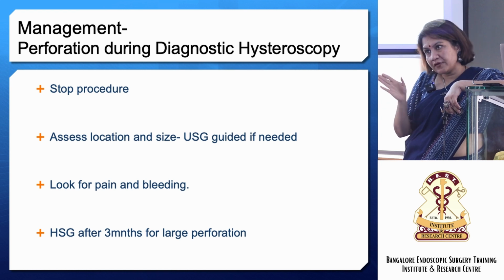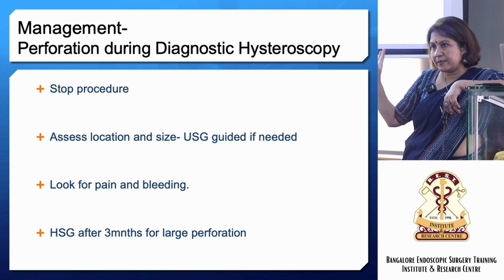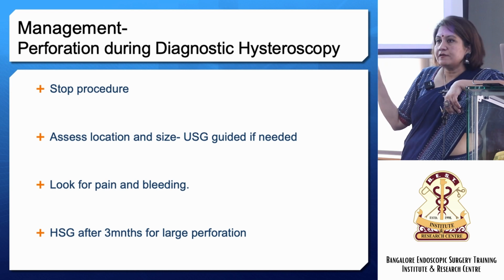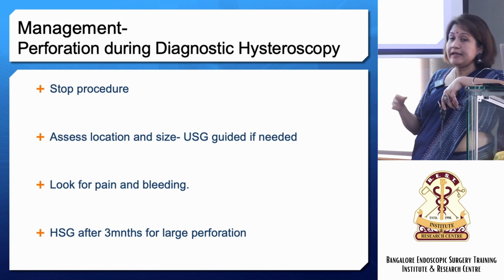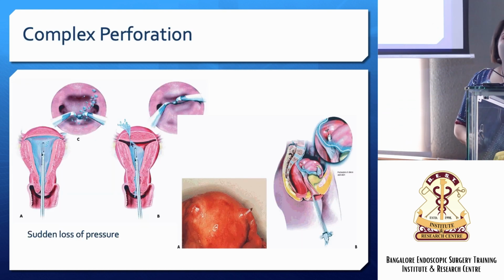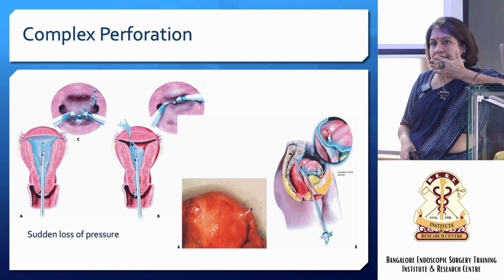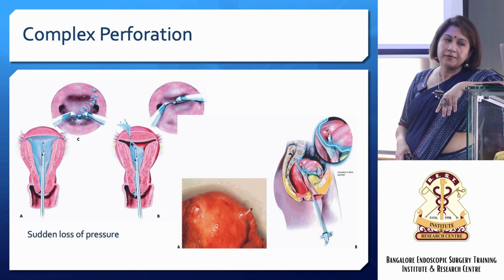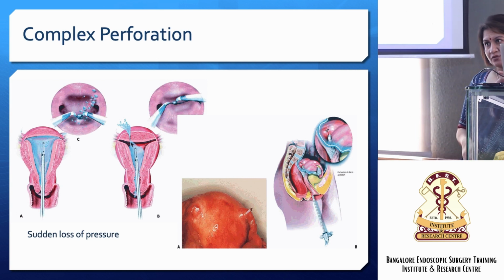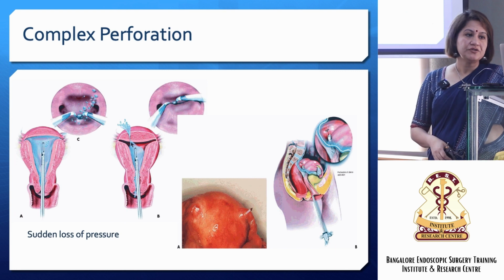The only concern is if you have perforated into the lateral wall and injured the uterines and caused a broad ligament hematoma. So you can just observe the patient for 24 hours. If the vitals are stable, you can discharge them. Only if you have done the perforation with an operative instrument, when it is active, especially if you're using a monopolar system, the monopolar gets conducted throughout the body, and there is a risk of injuring a distal organ beyond that. So you have to do a laparoscopy to make sure that you have not injured any bowel or bladder where the perforation is.